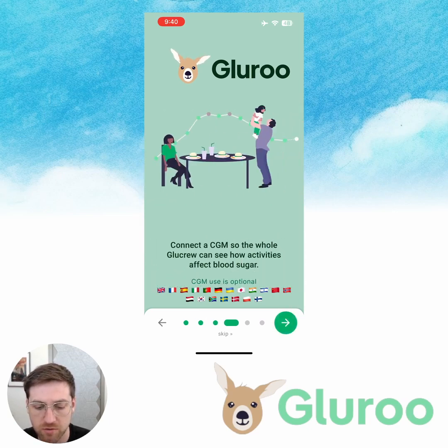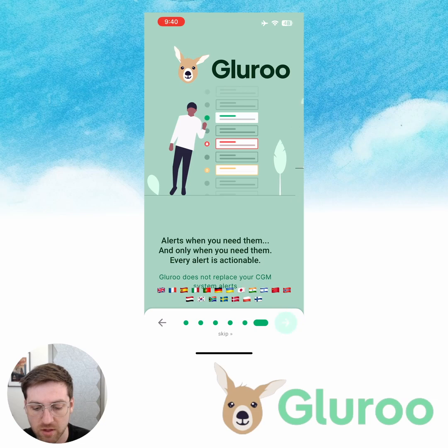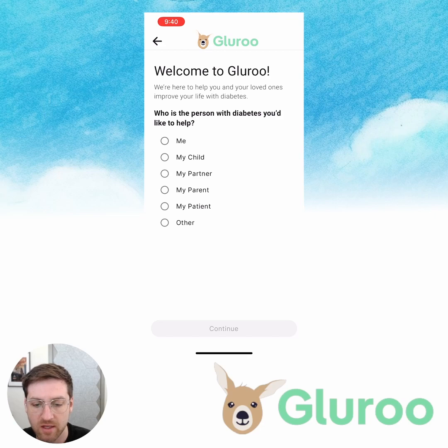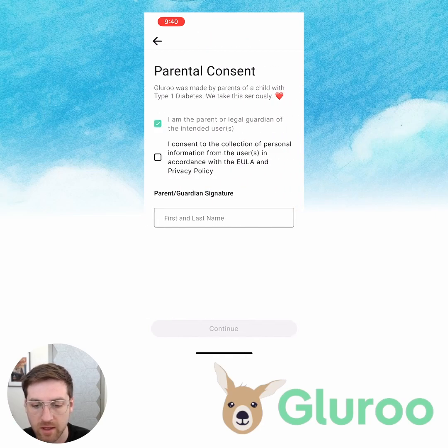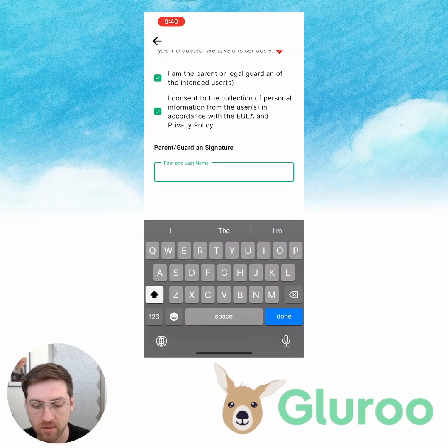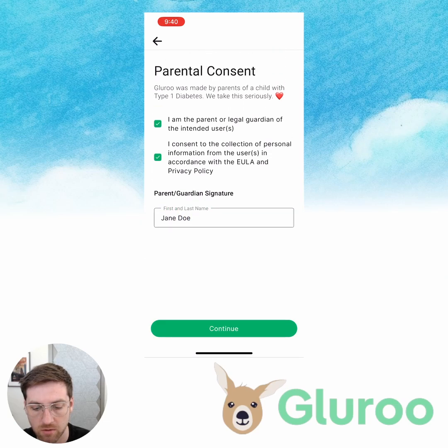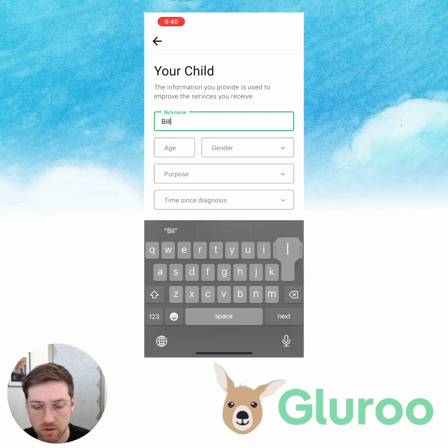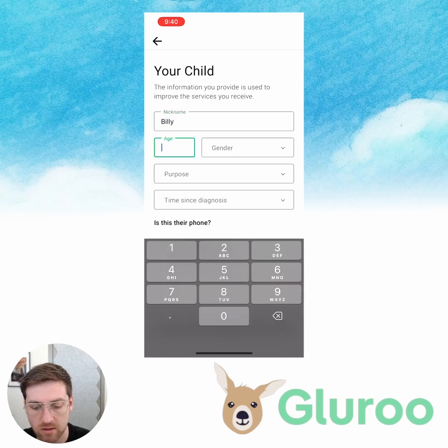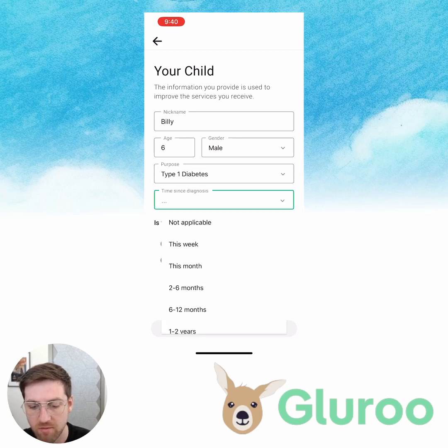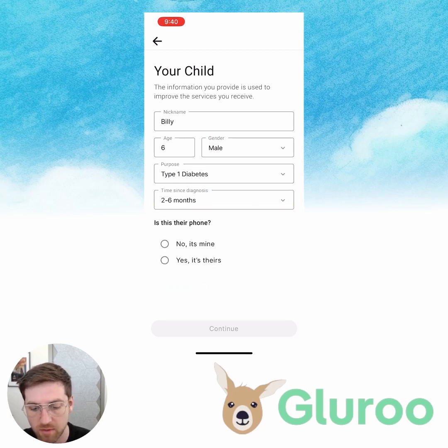I'm just going to browse through the onboarding screens here and I'm going to select to create a new account. In this case, the person with diabetes I'd like to help is my child, so I'm going to give them parental consent. I'm going to put my signature in here — I'll be Jane Doe. My child's name is Billy. He is six years old and he's got type 1 diabetes; he was diagnosed a couple months ago.